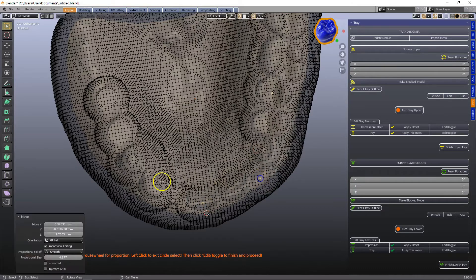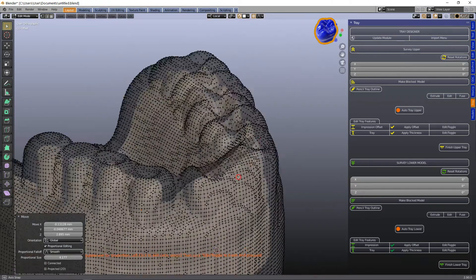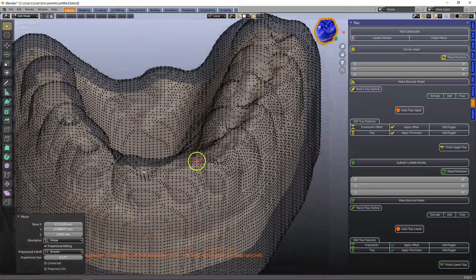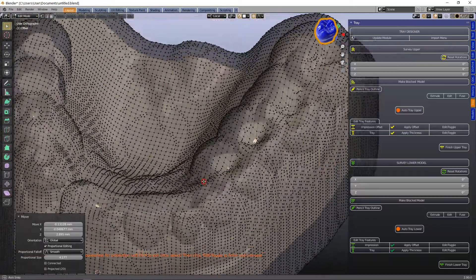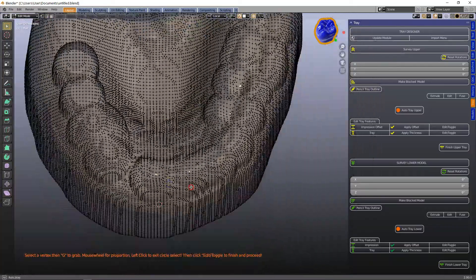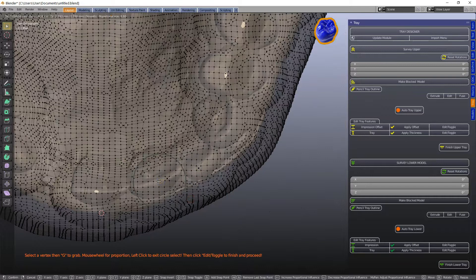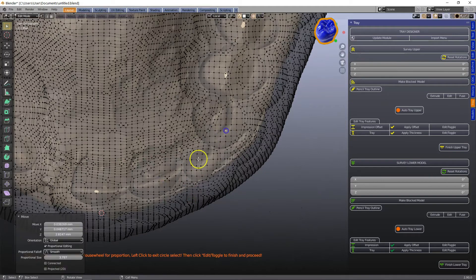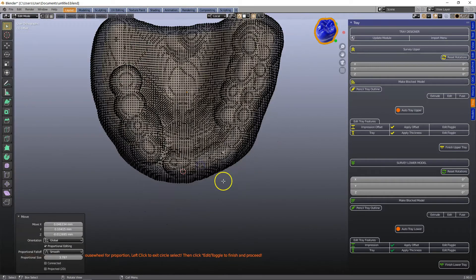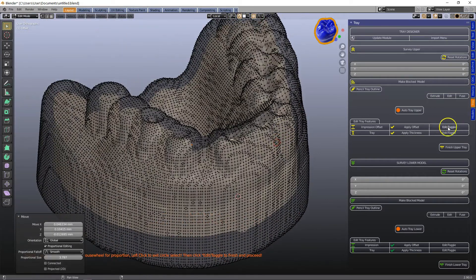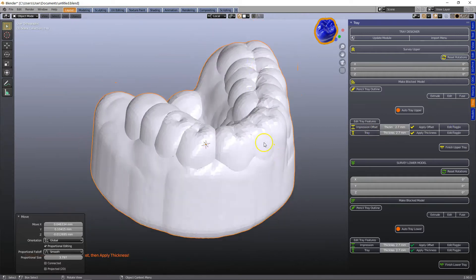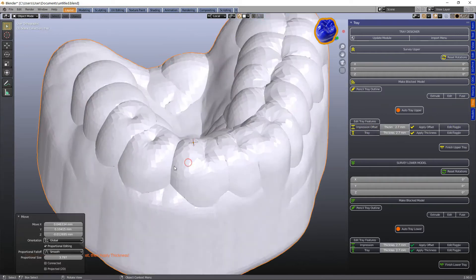So as you can see it will diminish that space layer to nothing. So I'm going to make a few more. G to grab and let it just snap to the incisal surface and then we're going to toggle out of it and make our tray layer.